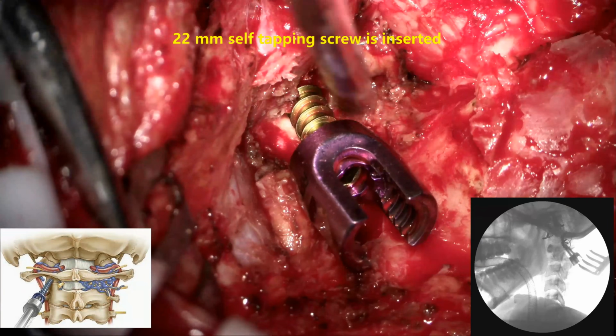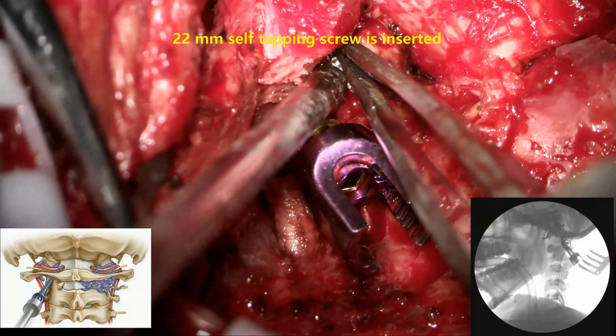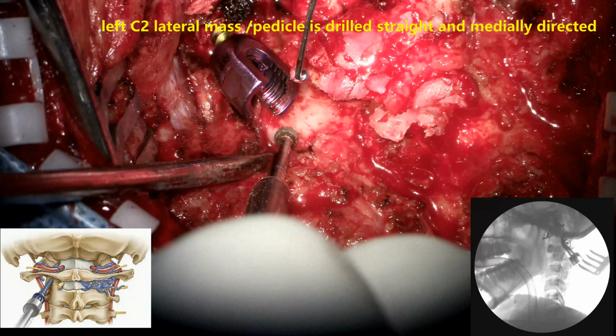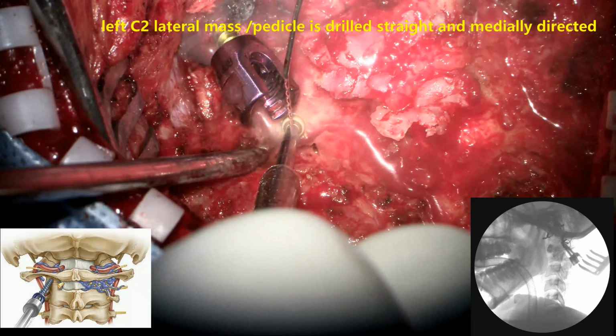It is put under X-ray or fluoroscopic control on both the sides. Again, there may be some amount of bleeding from the site where we have inserted the screw, and it is controlled with the Surgicel and the bone wax.